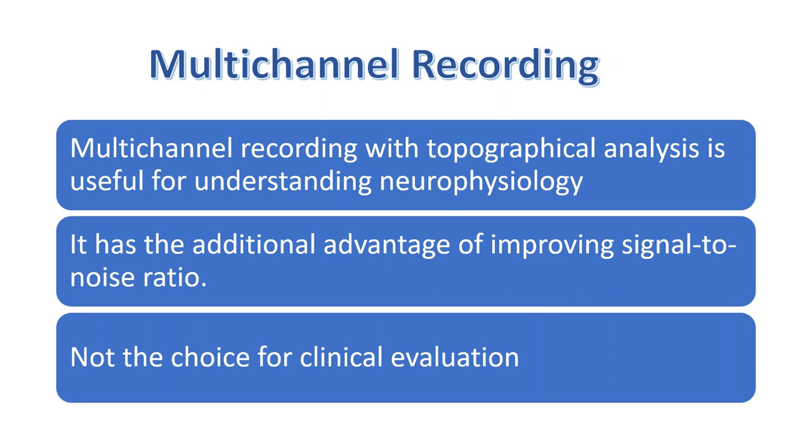And multi-channel recording gives us a lot of information about neurophysiology. So it helps us in understanding neurophysiology, and it has the advantage of improving signal-to-noise ratio. That is, getting clear, artifact-free waveforms is easier with a multi-channel recording than with a single or a dual channel. But definitely that is not a choice in routine clinical evaluation.